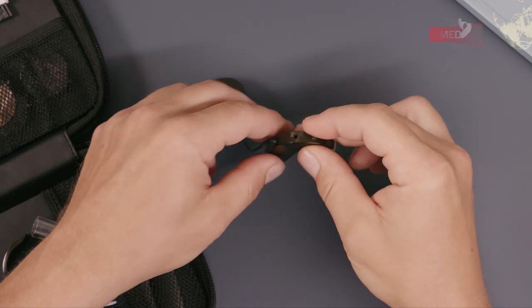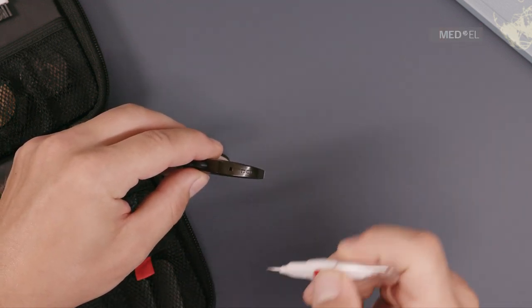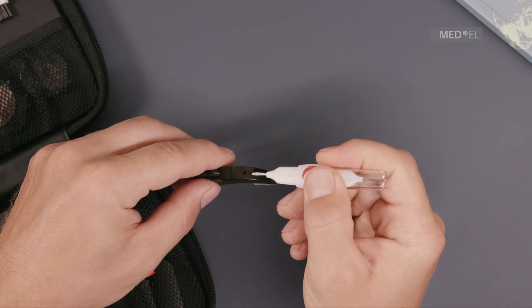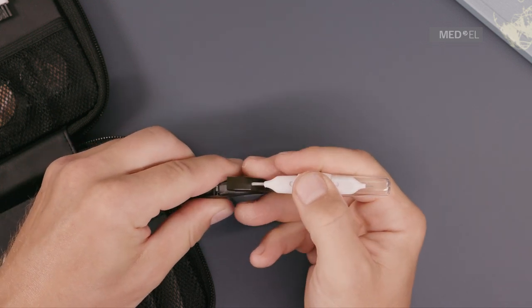To remove the old microphone cover, insert the screwdriver into the groove at the bottom of the microphone cover. Gently lever the cover away from the control unit in the direction of the earhook.